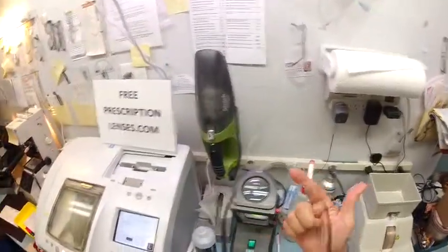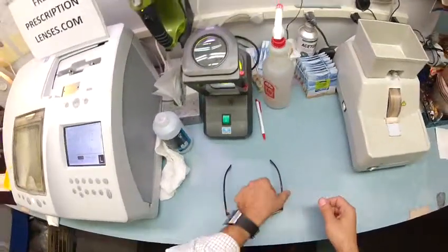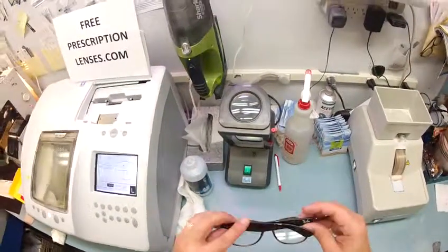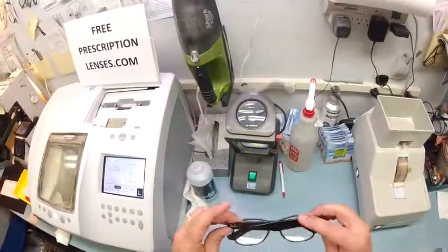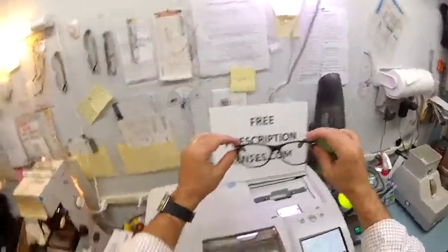But I'm going to get yours in standard alignment, meaning a 3-point stance, 1, 2, and the bottom of the frame being 3. I put yours on the counter, there is no wobble. Flip it over, set it down, there is no wobble. I'm going to close each temple to make sure they overlap perfectly, and they do, and the same amount of tension on each side. And now I want to go ahead and activate them, which means turn them dark.